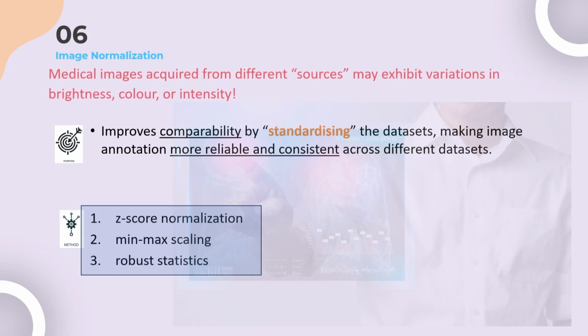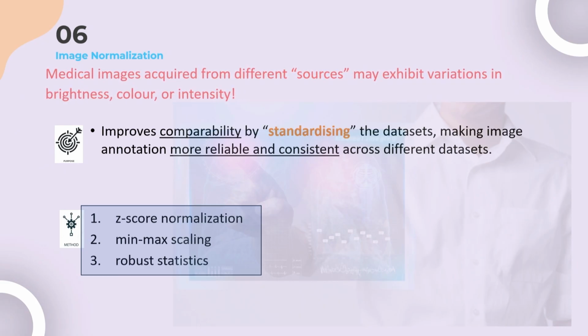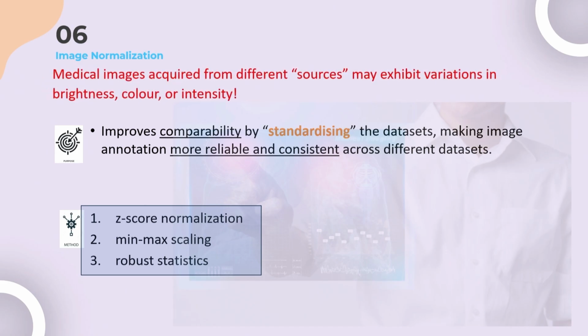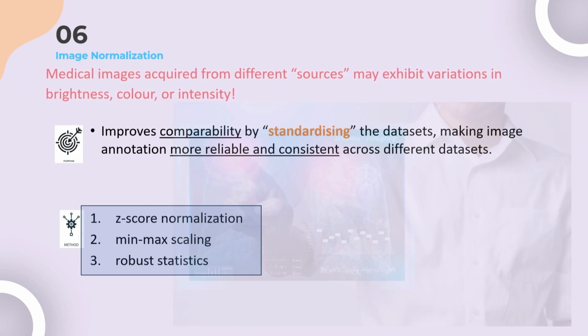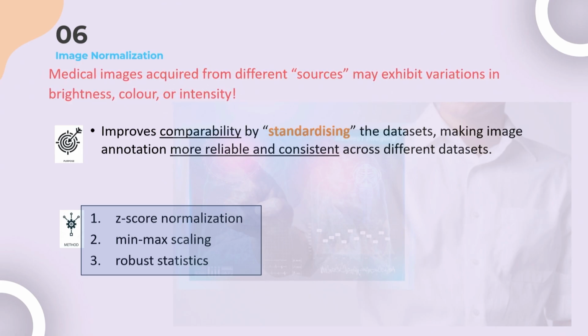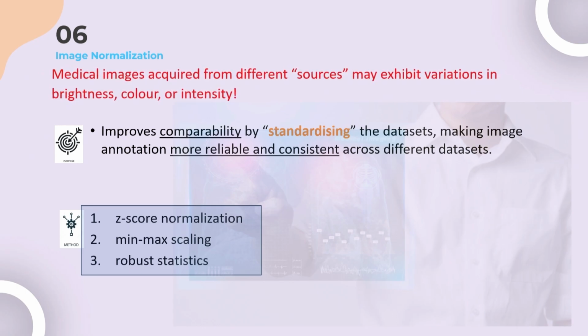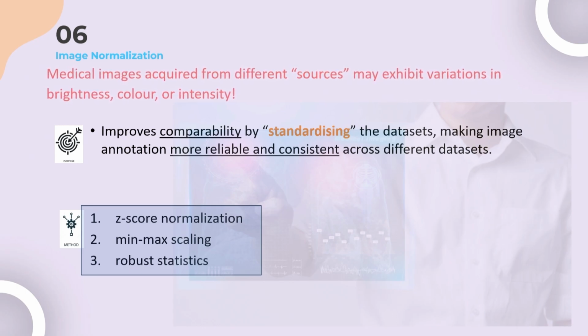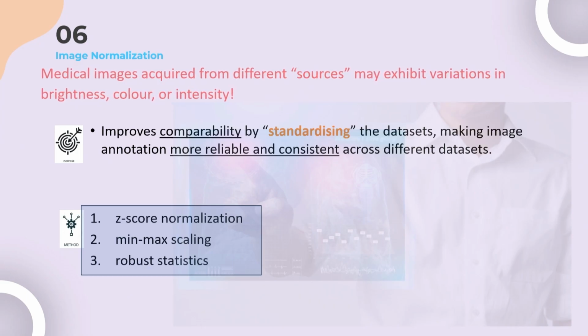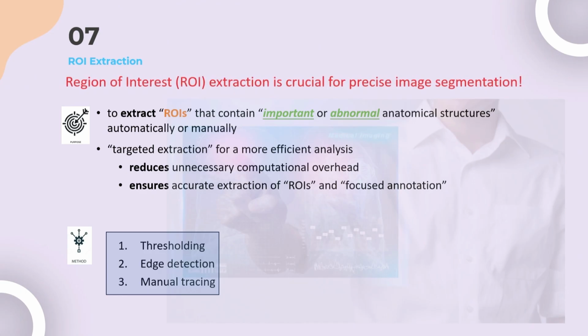And this is about the standardization across different images. Images can be from different vendors. Even though they collect the same images, they have different parameters and different settings. So all this may have certain implications for the final image quality. So we can do something to standardize across different images before we fit the image into the AI model.